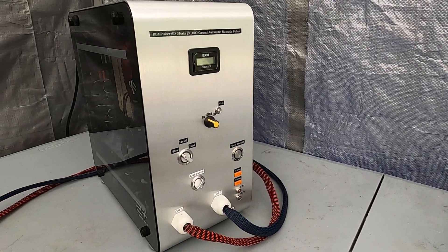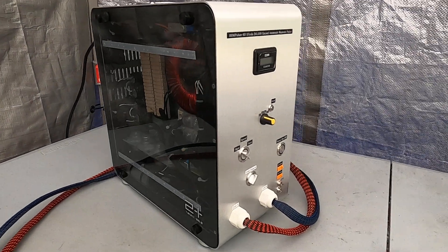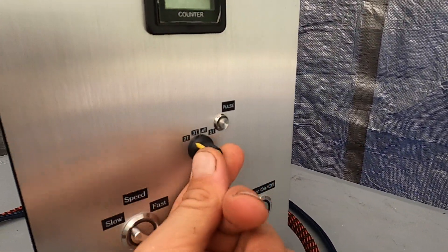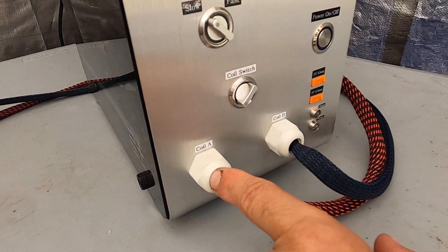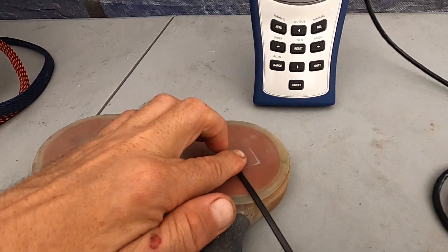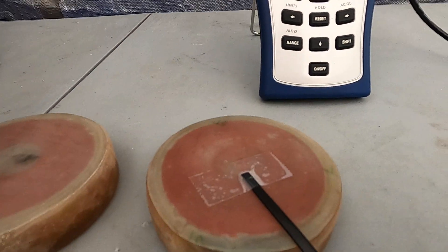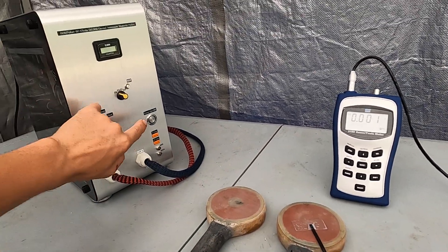So let's go ahead and power it up and take measurements for the first couple of seconds. Right now I have it on 2 Tesla, and I switch to the red coil — the red coil here — and my meter is attached to pick up the highest reading. On a count of 3: 1, 2, 3.